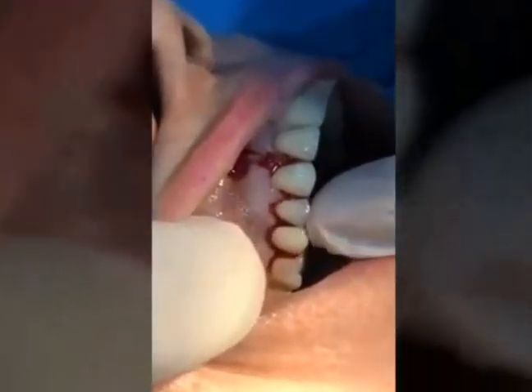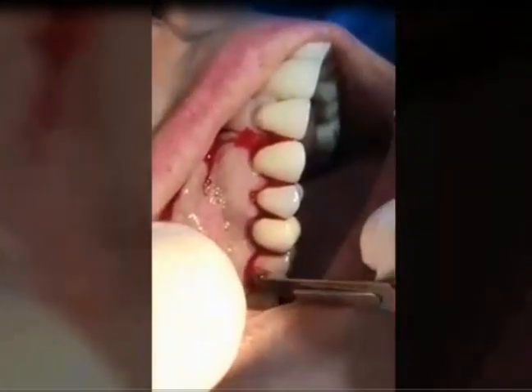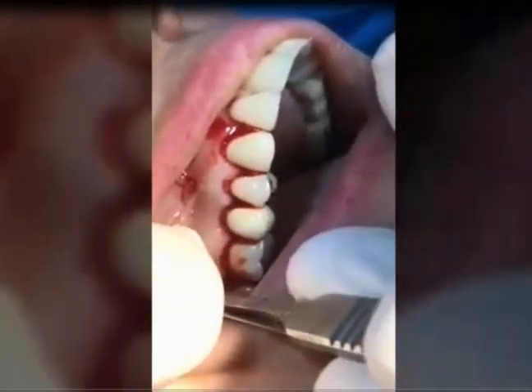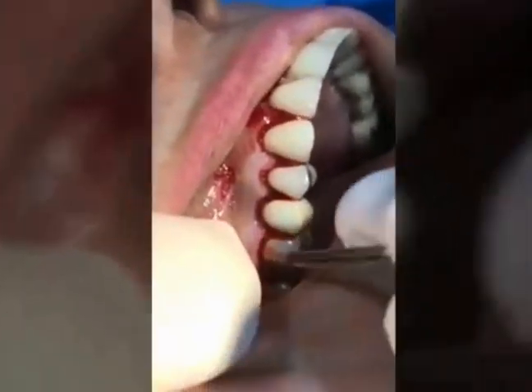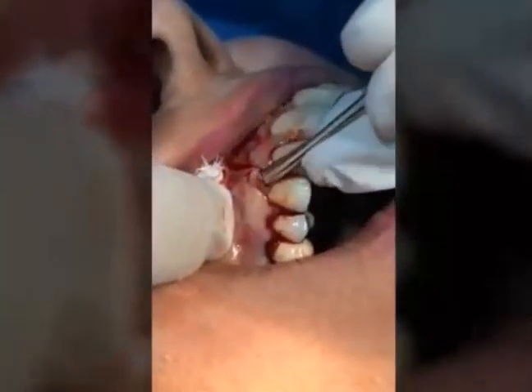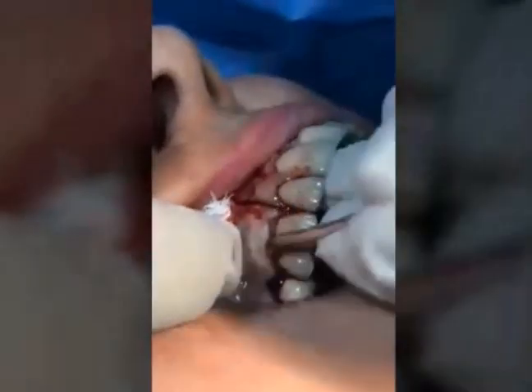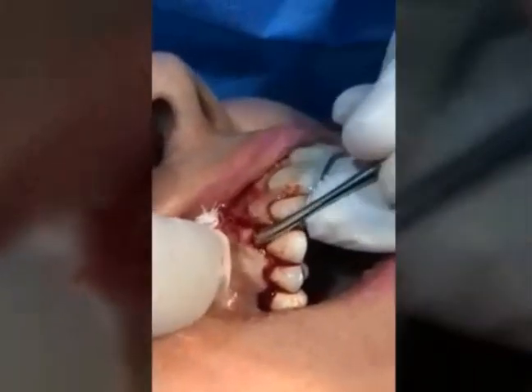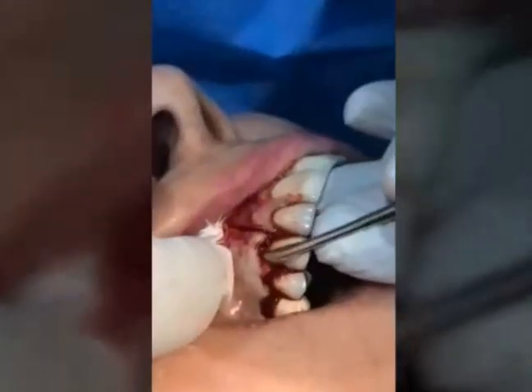As you can see here, this is the failed implant — it's quite movable. There is bone loss around the implant. The reason for failure was that previously there was a thin plate of buccal bone, and the implant was placed without restoring the lost bone and soft tissue, so failure was predictable.